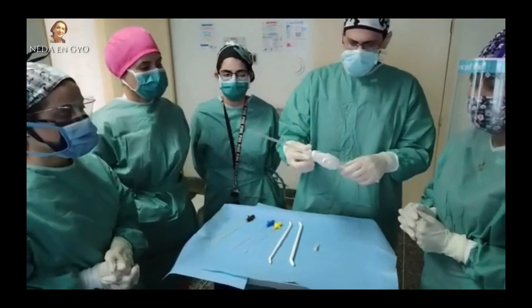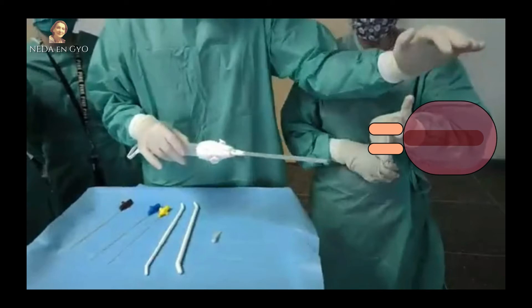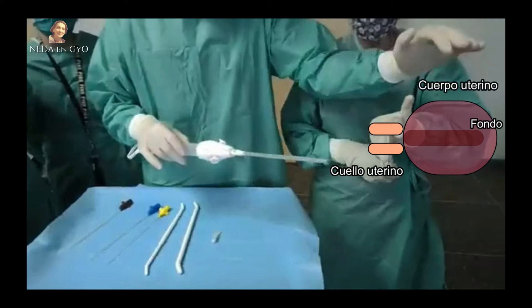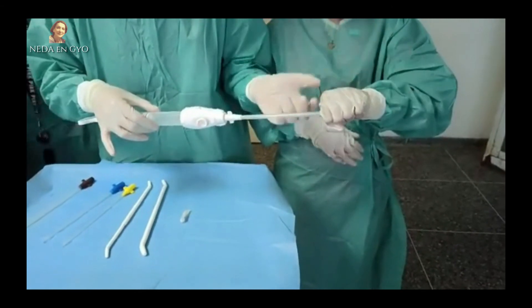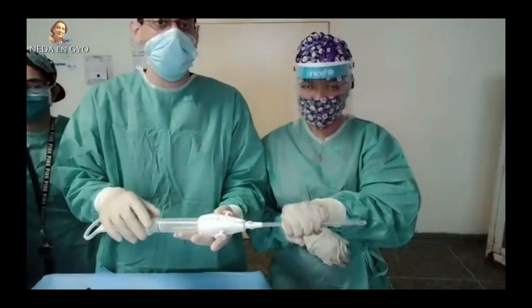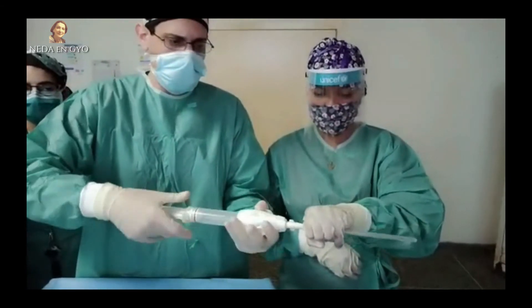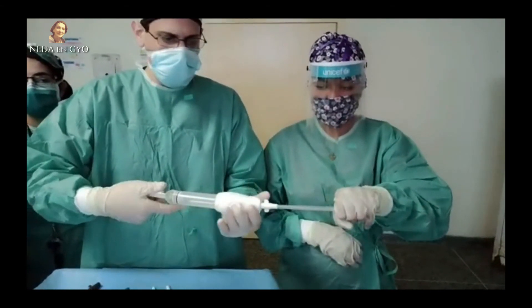Se realiza una simulación de cuello uterino mostrando el fondo y el cuerpo del útero. Al introducir la cánula por el orificio cervical externo hasta el fondo, se abren las tapas y empieza el sistema de aspiración. Se realizan movimientos circulares desde el fondo hasta el orificio cervical interno, llenándose el cilindro de restos. No se realiza raspado como en los métodos tradicionales; es una cánula flexible que trabaja con movimientos circulares.